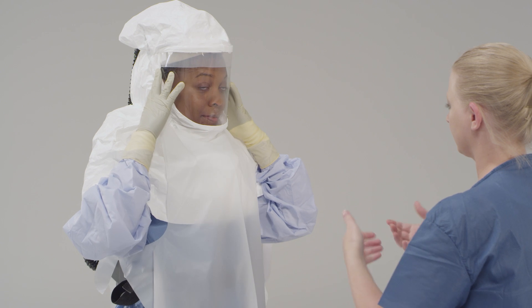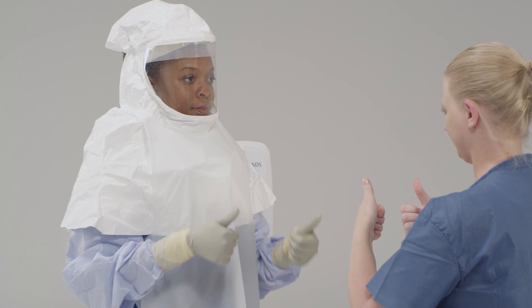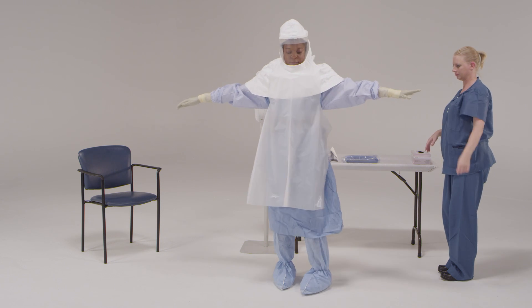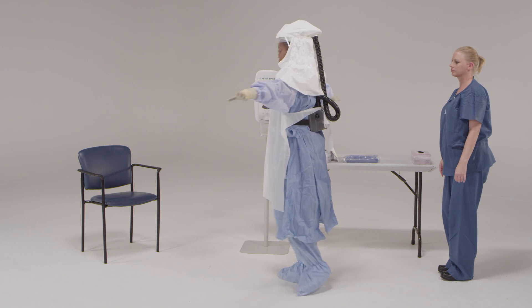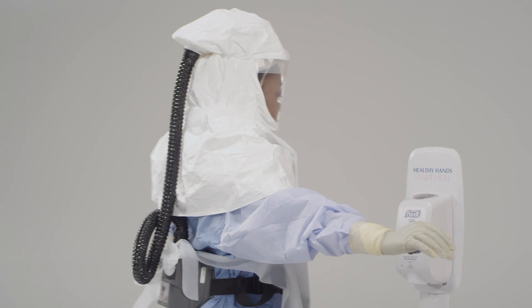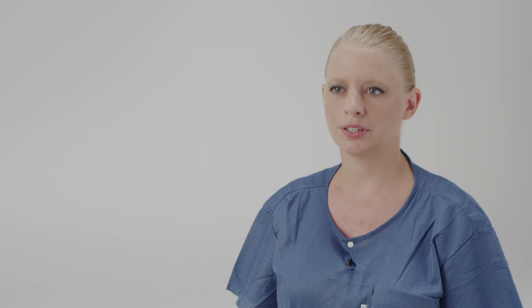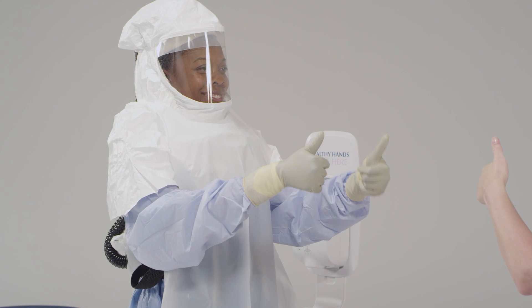After completing the donning process, the integrity of the ensemble is verified by the trained observer. Can you please hold your arms out to your side and turn around for me? I'm going to check to make sure that all of your skin is covered and you are able to move comfortably. The healthcare provider should have an unobstructed field of vision through the hood. A mirror in the room can be a useful tool for the healthcare provider while donning personal protective equipment. Can you please bend at your waist and lean over a bit? I want to make sure that you have full range of motion. Okay, everything looks great!